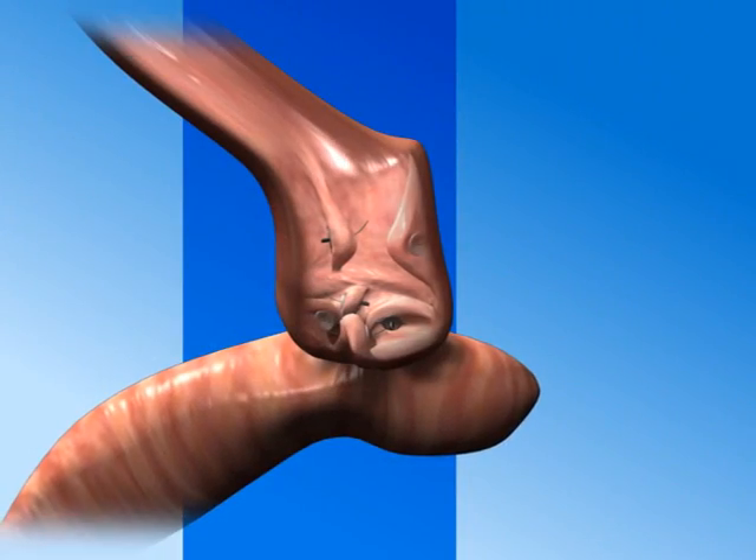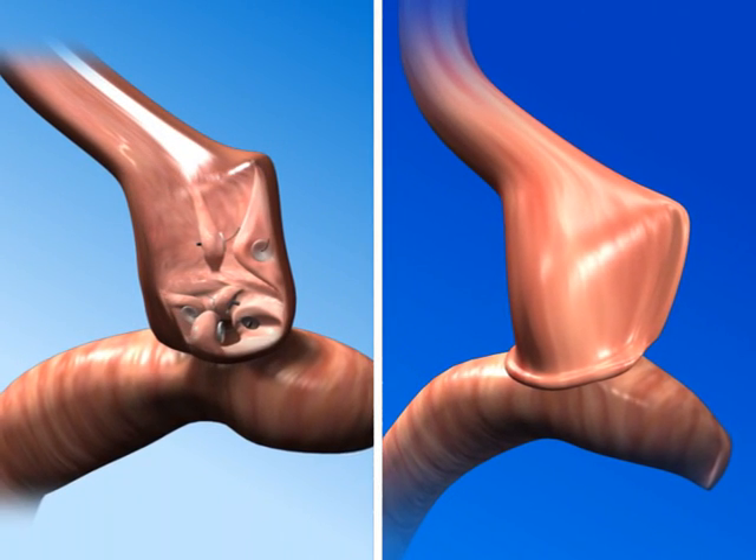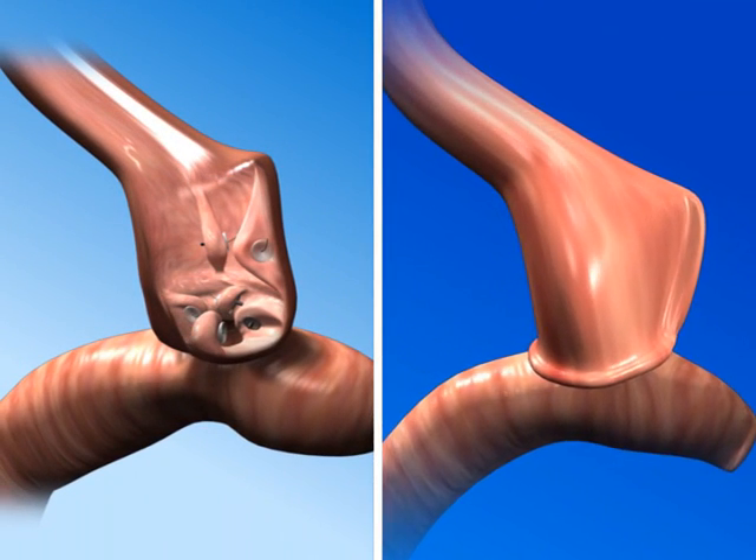When completed, the stomach pouch and the stoma more closely match the original post-bypass surgery dimensions without a single incision.